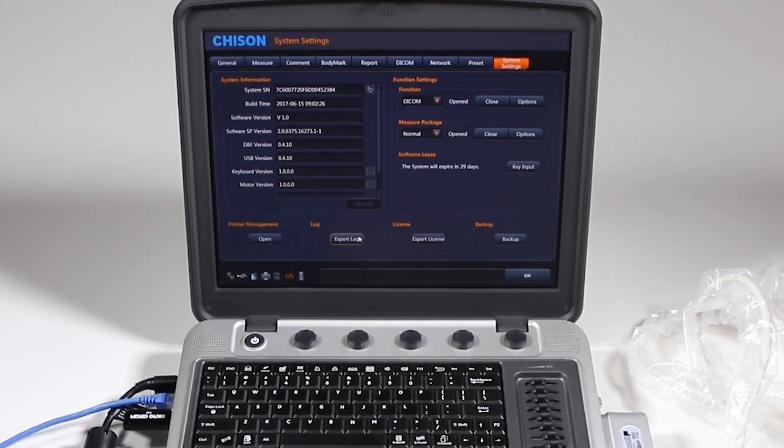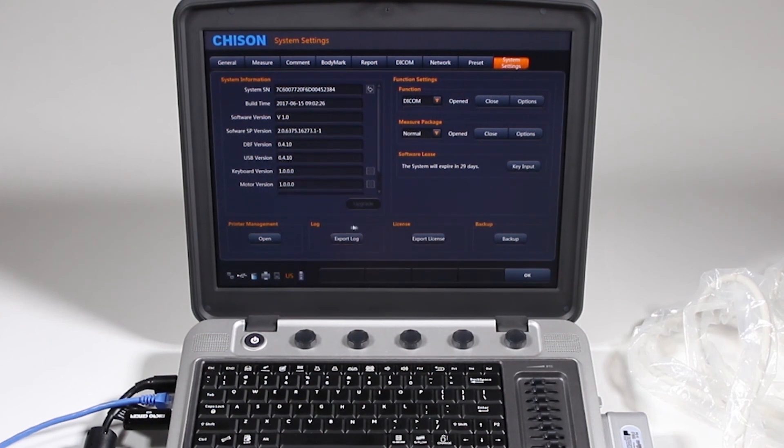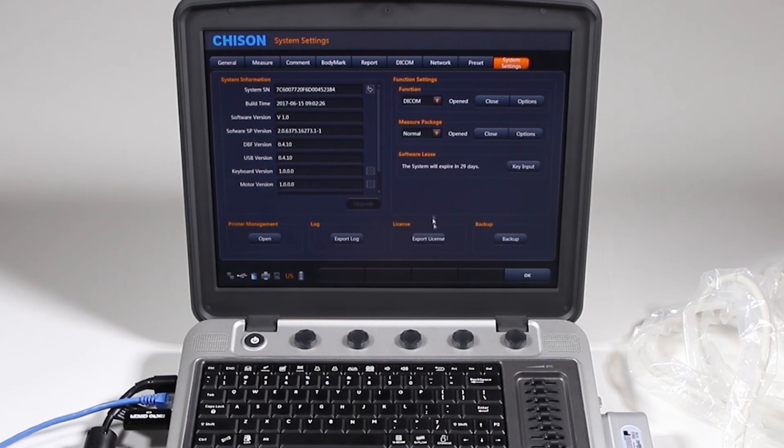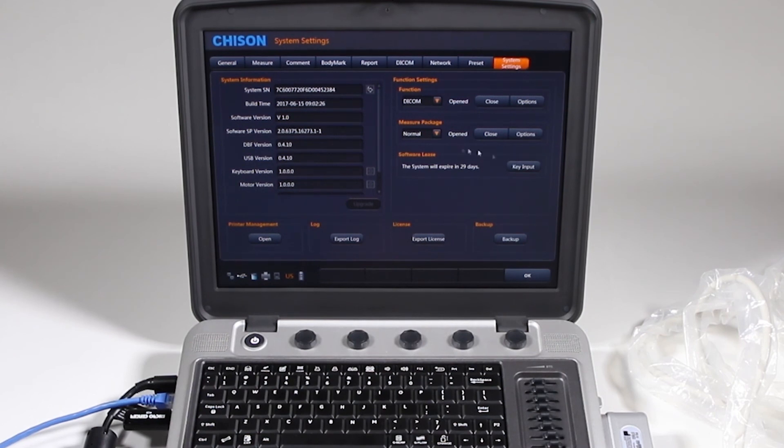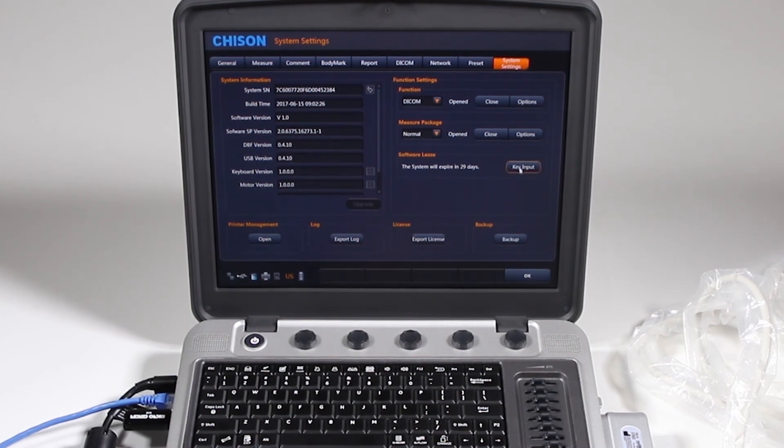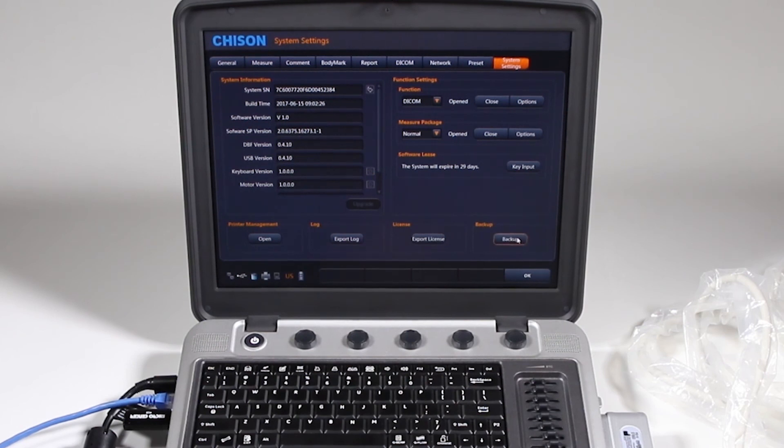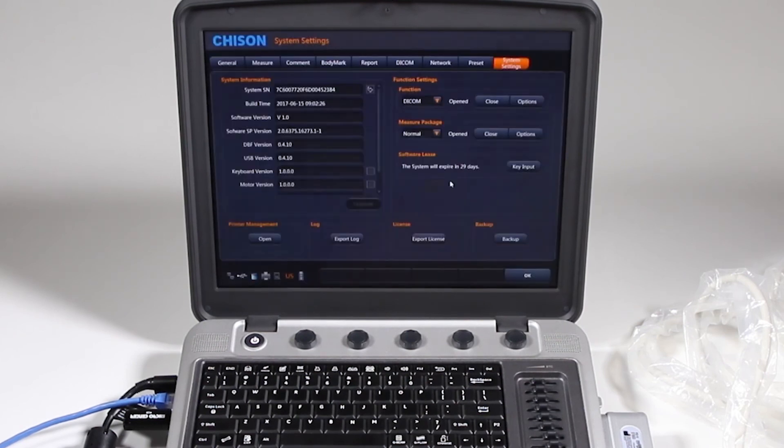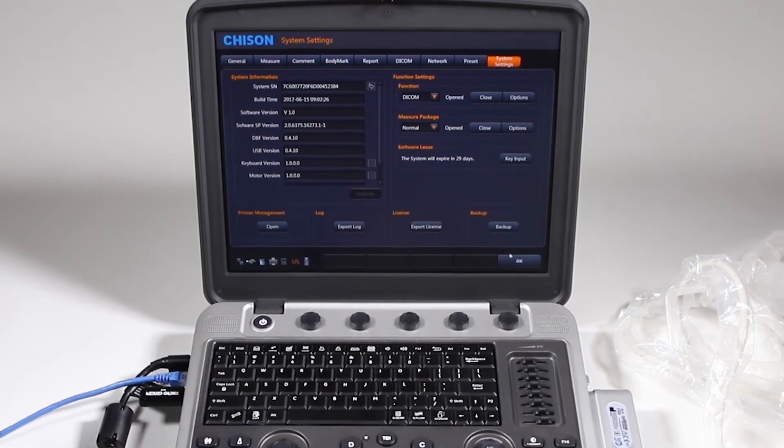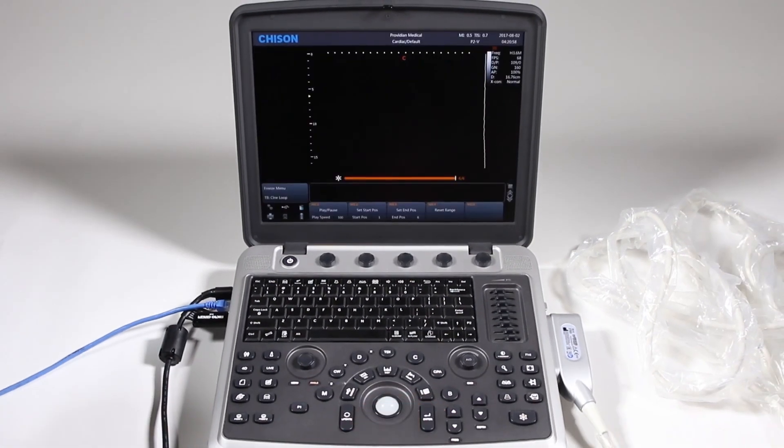This export log you may or may not be asked for. License key you can export that for importing later. And these basically just tell you what's available and what is not on your system. If you do not have a license key yet you would put that key input there. And here you can back up all your patients in the current system. Click no. Click ok.